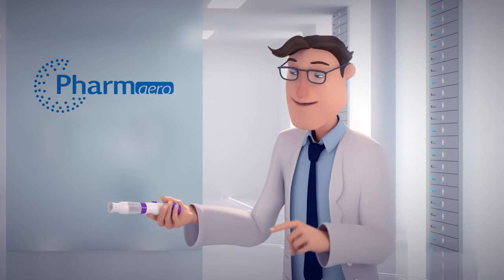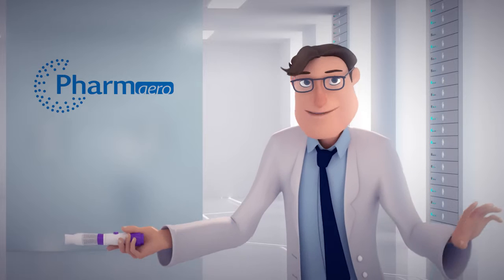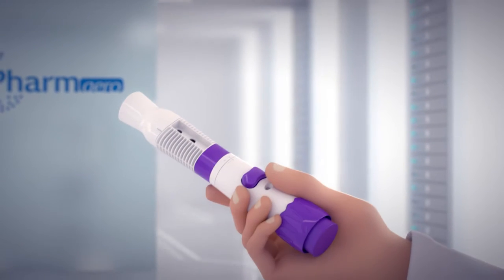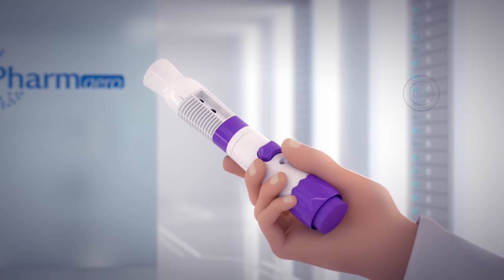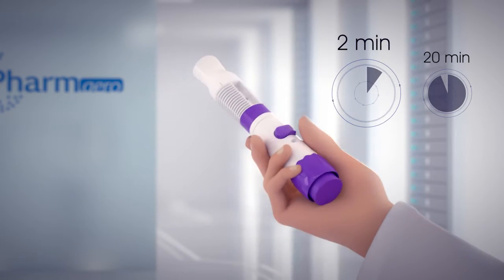The drug container is a pre-filled syringe or cartridge, and the spray nozzle is a silicon microchip. This product is amazingly efficient — it delivers the same dose of a drug in two minutes, compared to 20 minutes for a classic jet nebulizer.